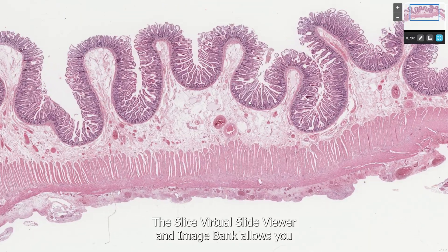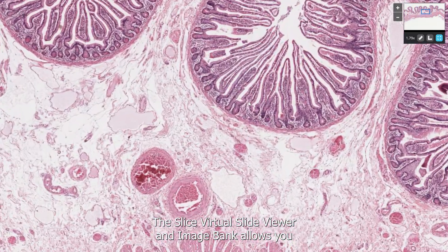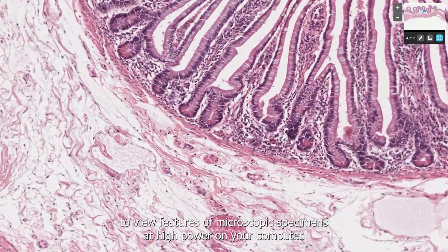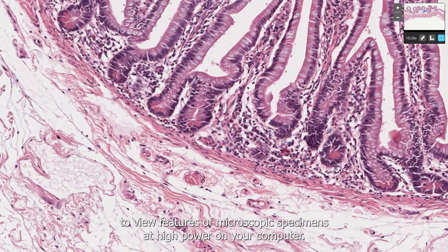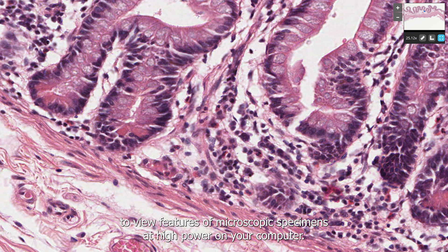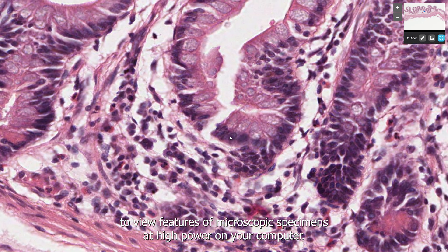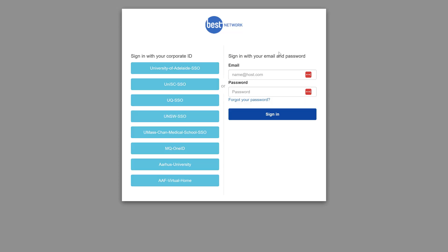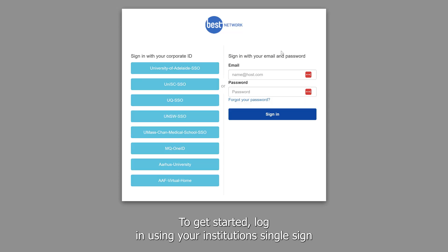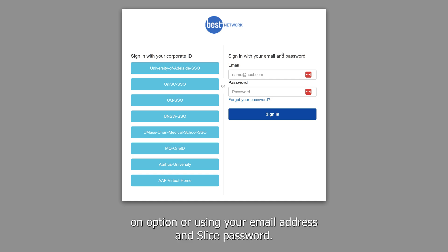The Slice Virtual Slide Viewer and Image Bank allows you to view features of microscopic specimens at high power on your computer. To get started, log in using your institution's single sign-on option or using your email address and Slice password.